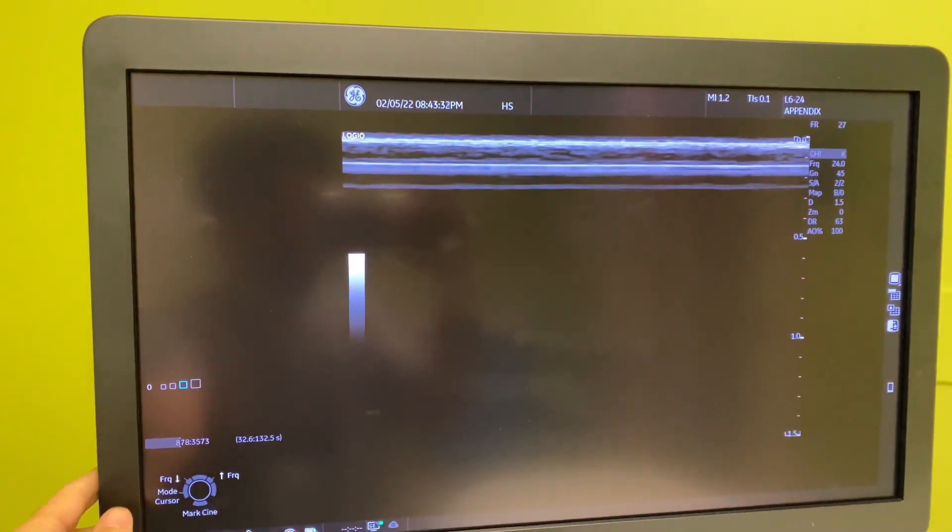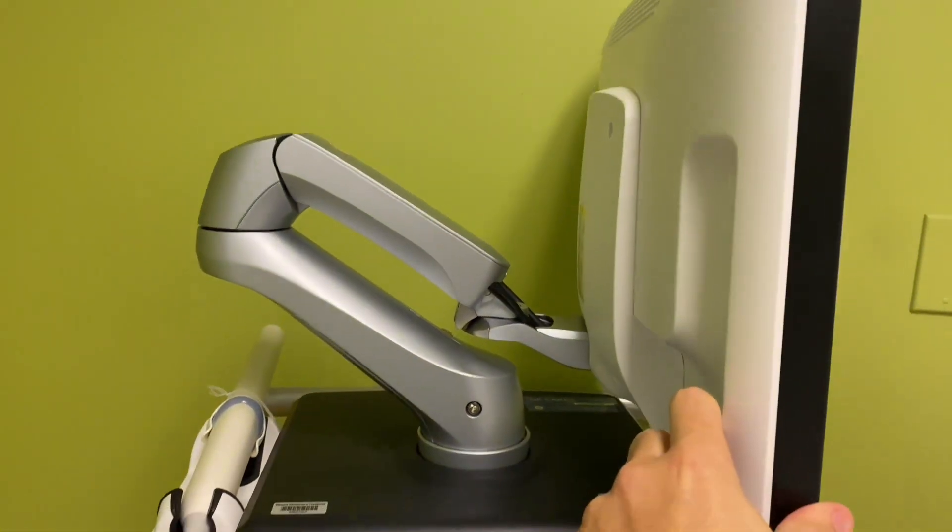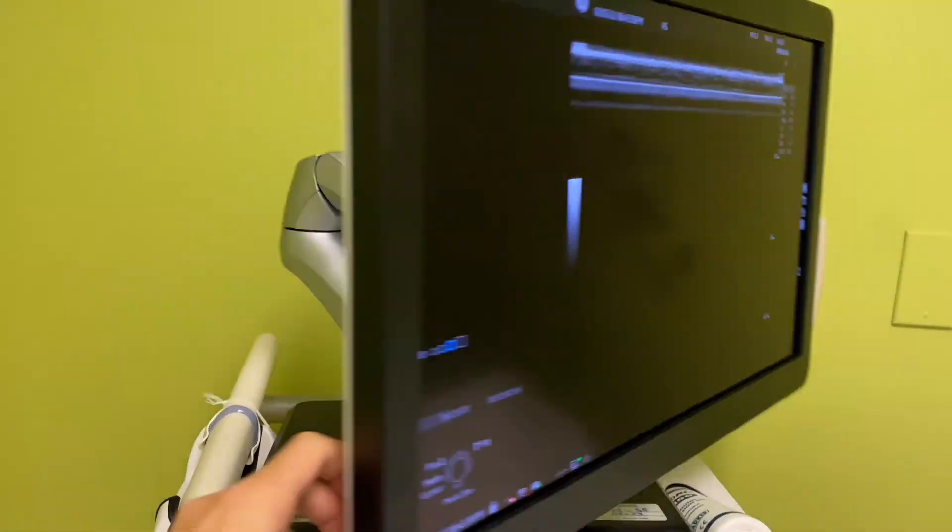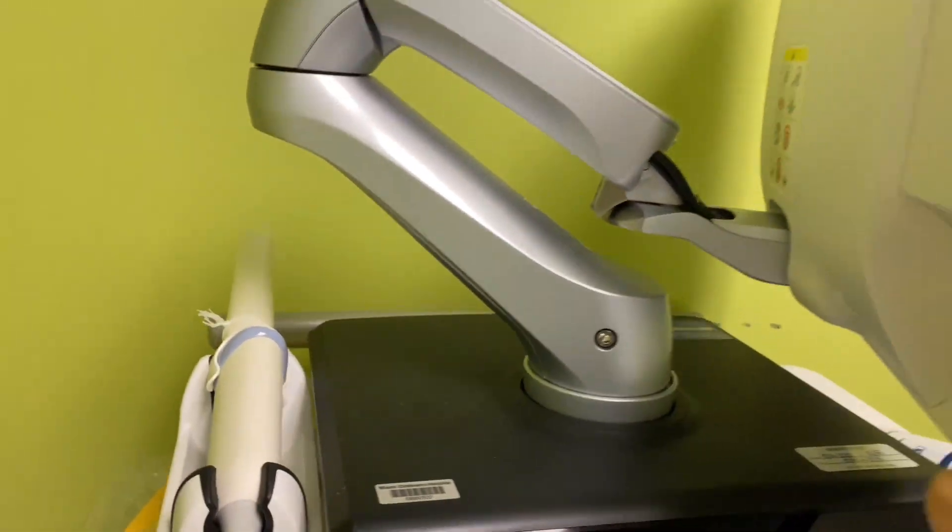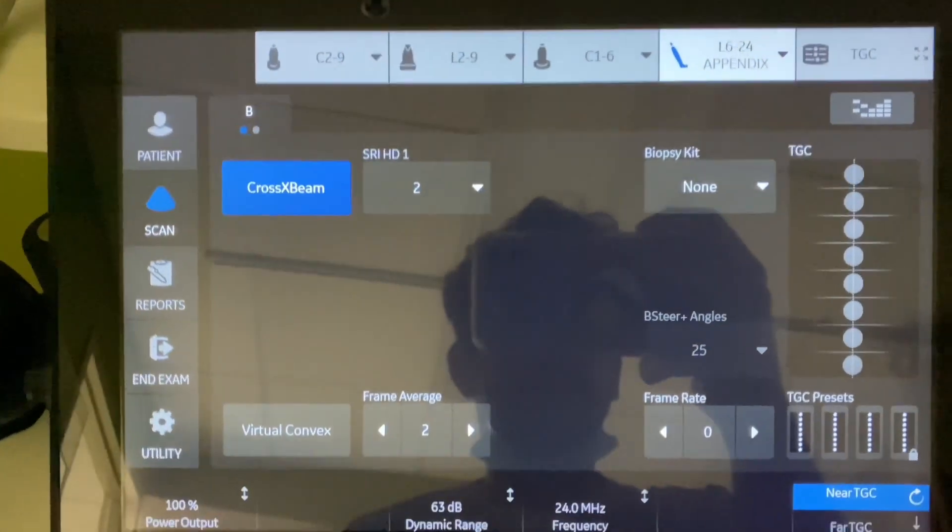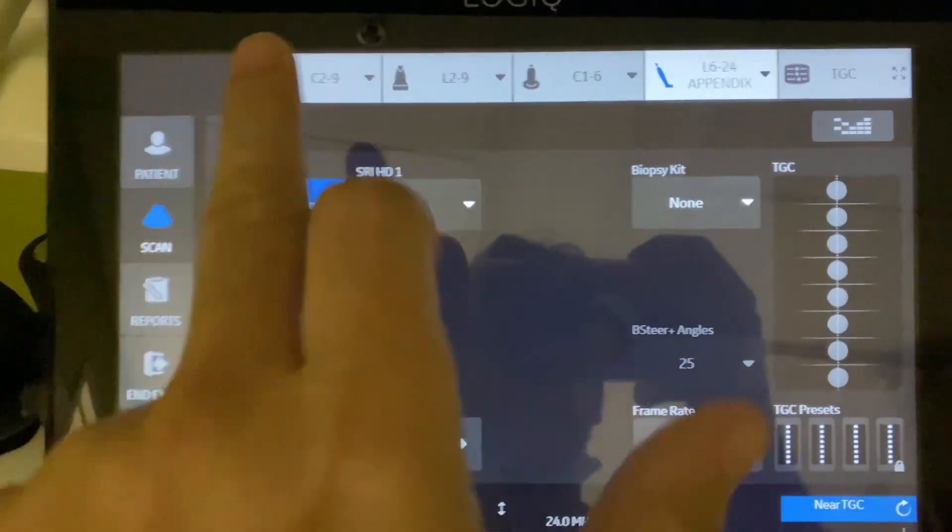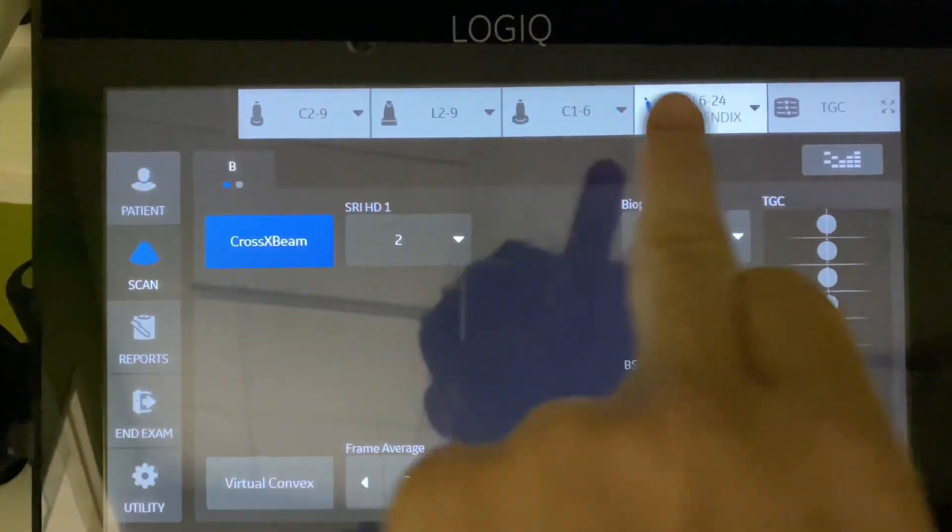We've always used the Logic Nines, so this is the new one. Screen pretty much the same, nice flat base. Here's the touch screen. All right, so there's your choice of transducers.